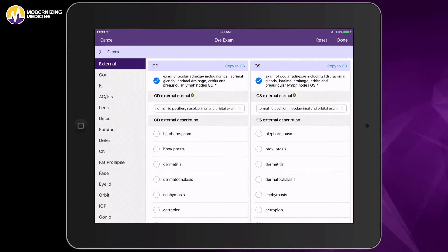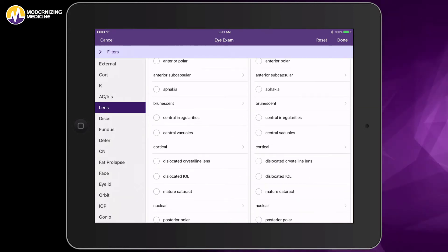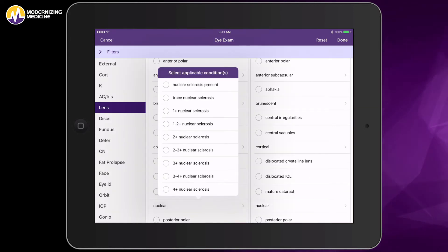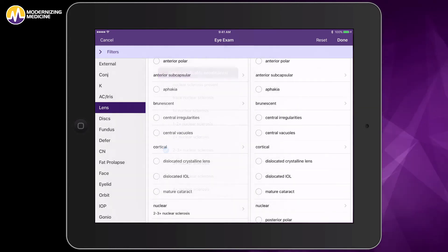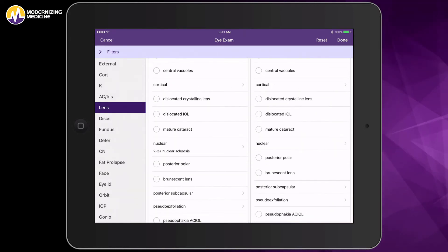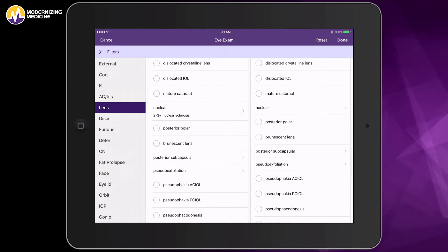I'm going to put my findings here for the lens, document a right cataract, and a left eye as pseudophakic.